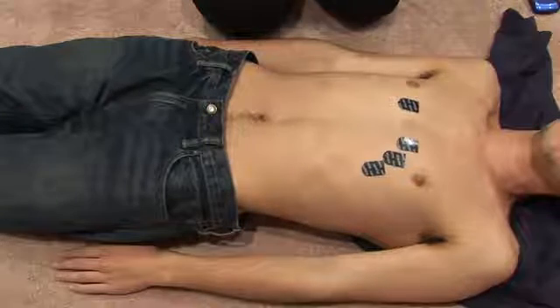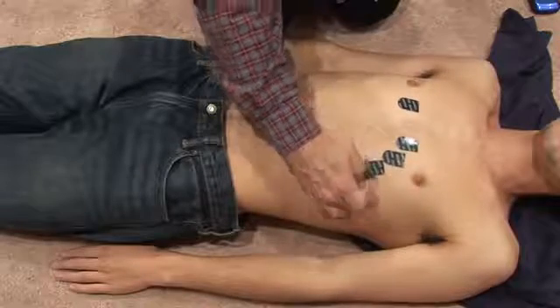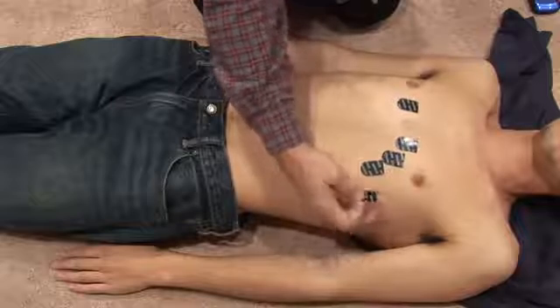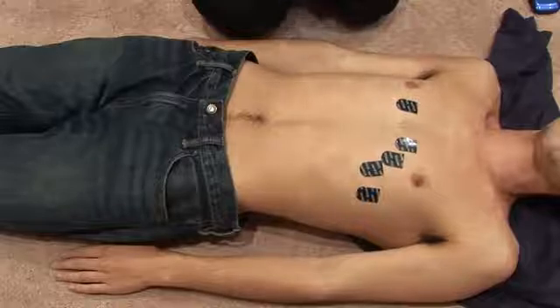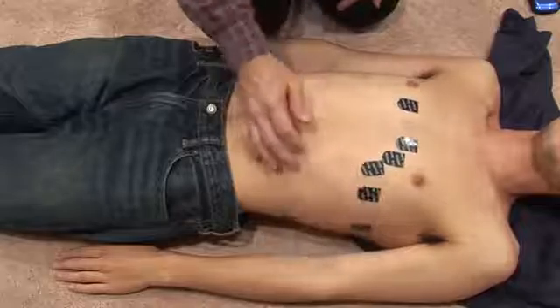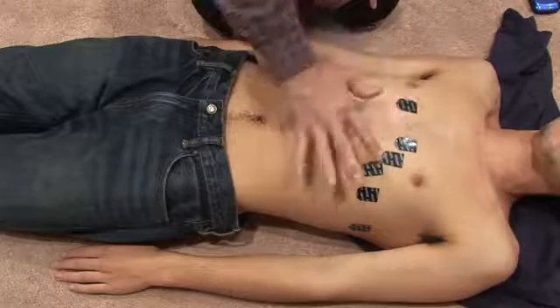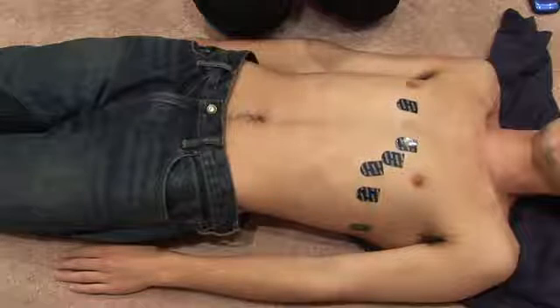And then V5, if you follow this space out, go more or less horizontally, the anterior axillary line, which is the furthest to the front of the side of the chest wall, that's where V5 should go, the anterior axillary line. And then V6 goes in the mid-axillary line, which is all the way on the side. Don't be afraid to go just underneath the armpit there, because that's where it belongs. And if you put your electrodes in this position, your V leads, your precordial leads, will come out looking properly.